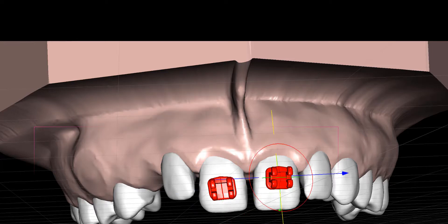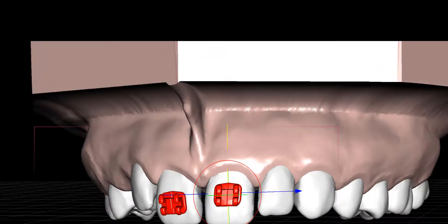This one is slightly different as you can see. It's an MBT prescription which is slightly different from the Roth because the point of application of the bracket is at 5 millimeters. In the Roth it's at 4.